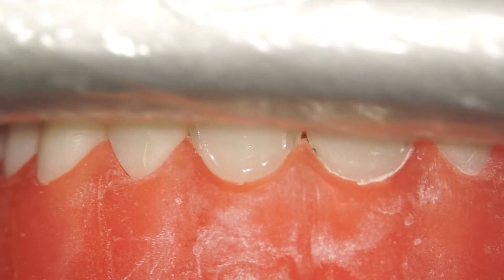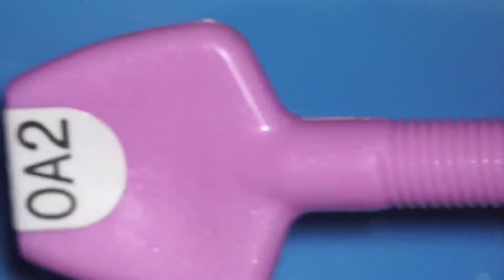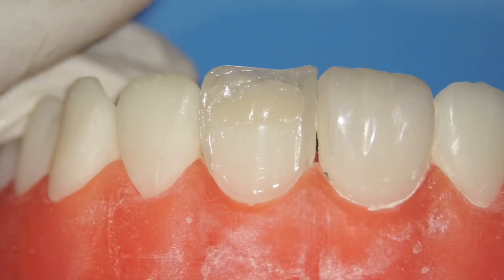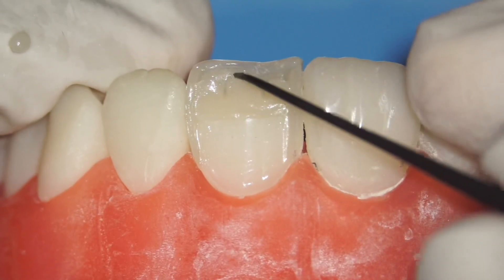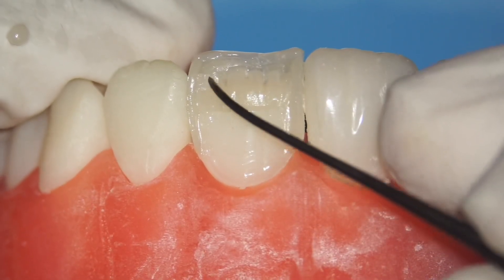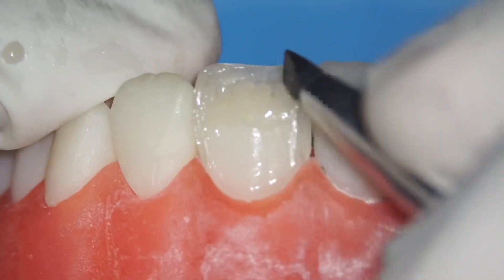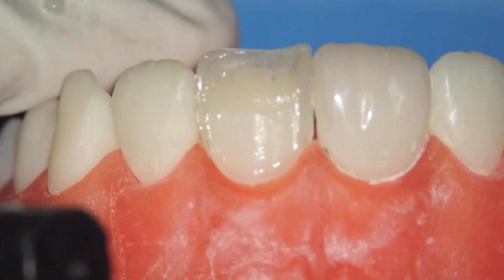The next step is dentine. I'm going to use OA2, which is an opaque shade of A2. Since this is mostly an enamel veneer prep, I'm only adding dentine at the incisal and half of the middle third — not at the cervical. I'm creating some mamelons using a sharp instrument — about six mamelons — based on your own creativity. Then use stick resin with a silicone brush to smooth everything out.